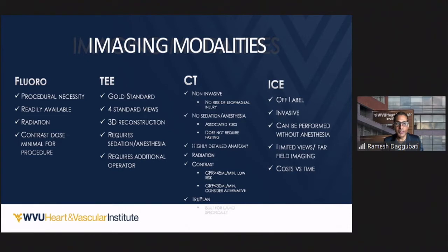Can I do all that? Yes, I can do all of that. I can stop and give treatment for bradycardia or check what is the cause of it. So, it does happen, and we have canceled one time. My partner canceled my procedure because of severe bradycardia and put in a pacemaker first, whereas I did not. I just gave them some atropine and put him on AP, which the anesthesiologist did, and the patient was fine, and we proceeded with the procedure, and that transient bradycardia resolved on its own.